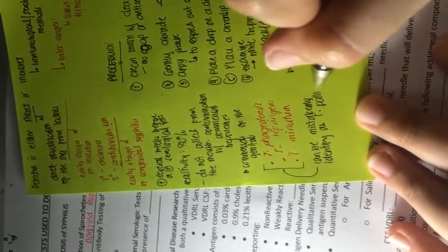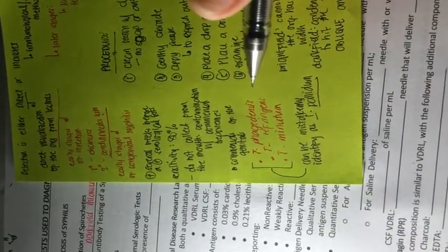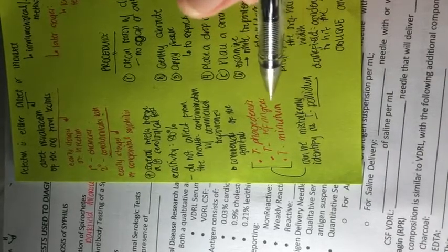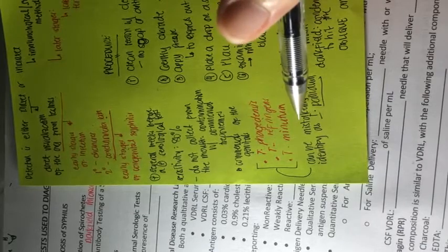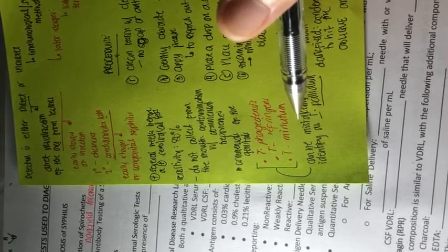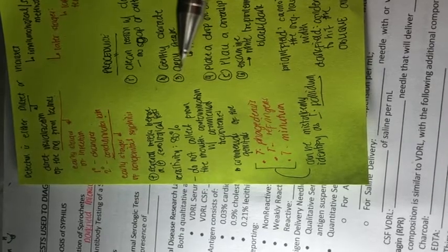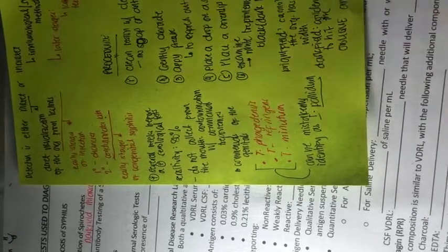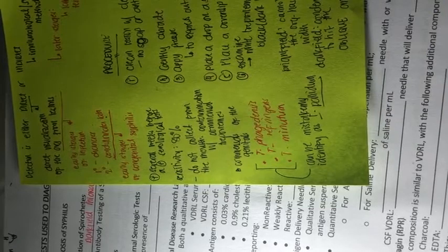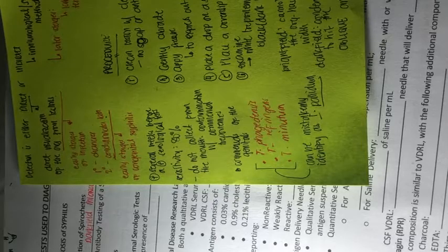T. pallidum. So you might ask, ma'am, how can they be mistaken as T. pallidum? Because the difference between Treponema, Borrelia, and Leptospira is actually their morphology. And if you are to use direct microscopy, we cannot really identify the organisms down to their species level. So we can only identify them based on their genera, so either Borrelia, Leptospira, or Treponema, but not as specific as the species level.